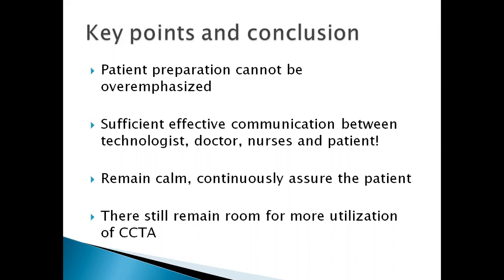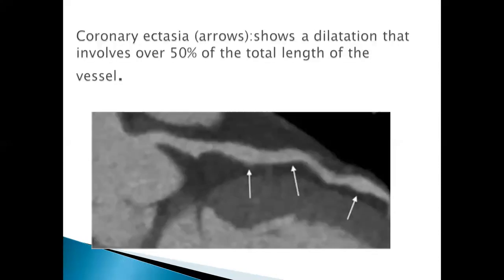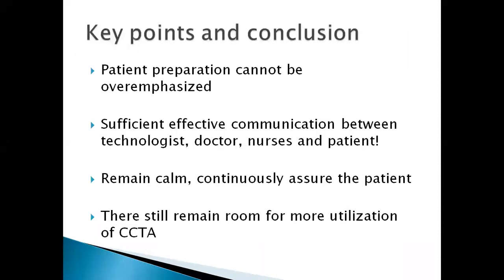Most doctors don't usually send the patient to come and do cardiac CT angiography. So it's not so utilized, but there's room for more utilization, as we have seen that it can provide all this information.